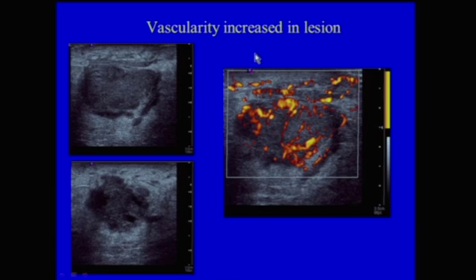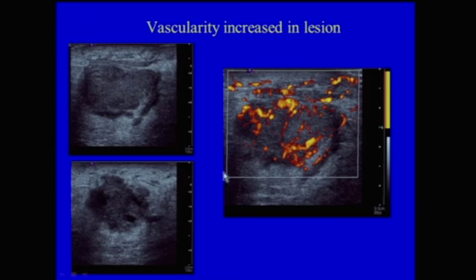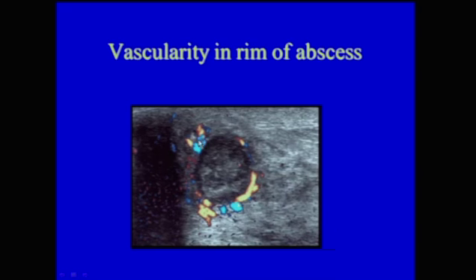Regarding the effect on vascularity: here is a very irregular mass with edema surrounding it — a suspicious mass showing increased blood flow not only to the mass but in the surrounding edematous tissue. A different patient shows only increased flow in the rim of the mass. The mass is well circumscribed and heterogeneous with no flow within it; the flow is in the surrounding tissue, and this is an abscess.